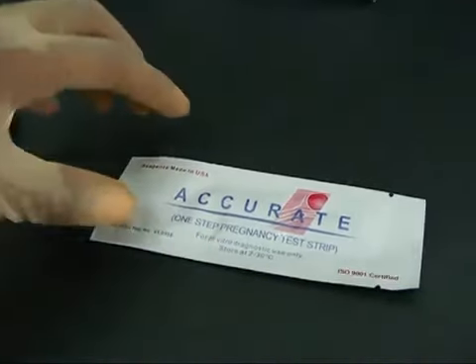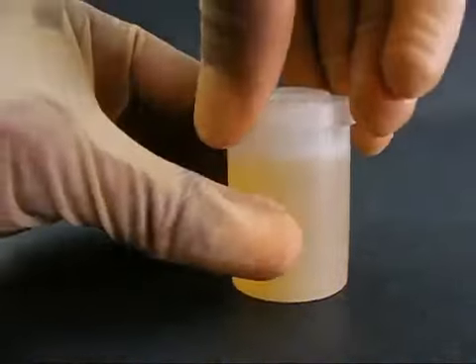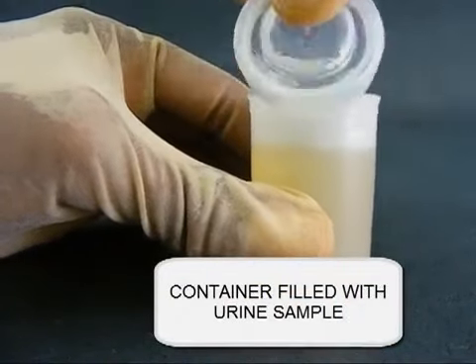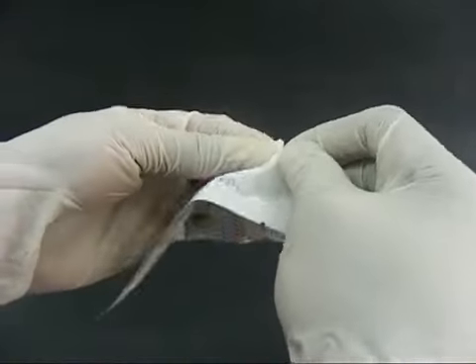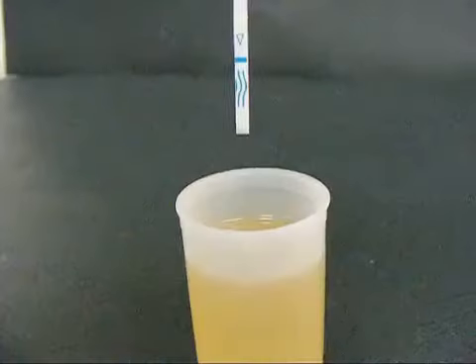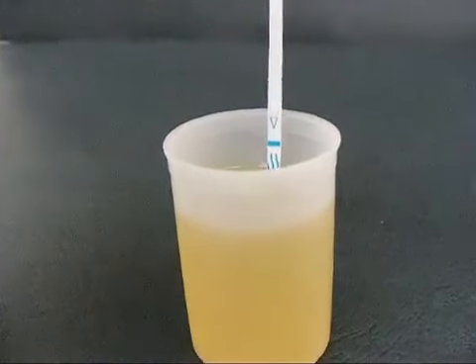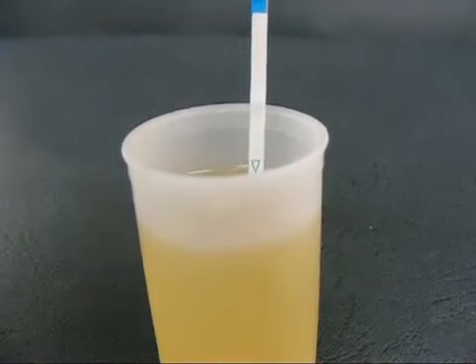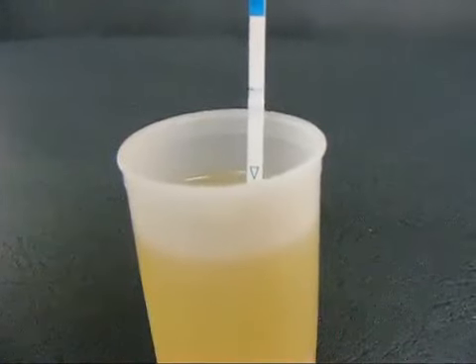The one-step pregnancy dipstick test involves the use of a one-step pregnancy test strip. The test strip is dipped in the urine sample till it gets to the blue mark. The test device is then allowed to develop.